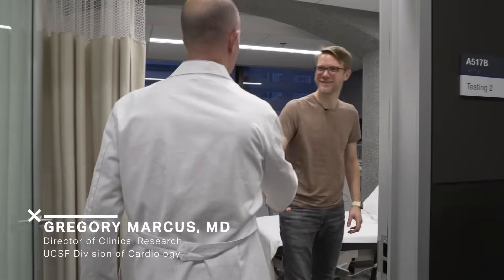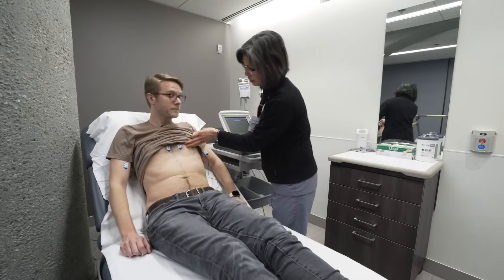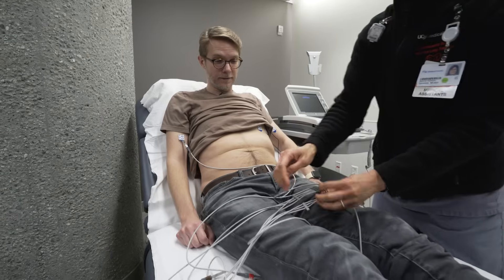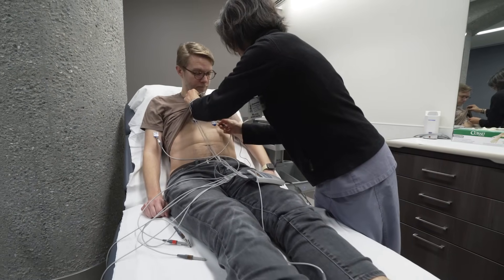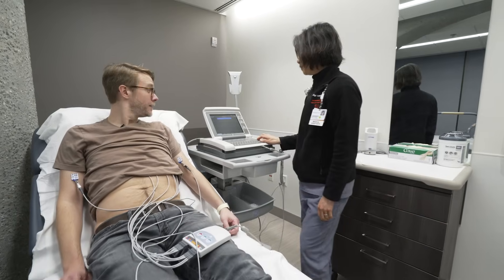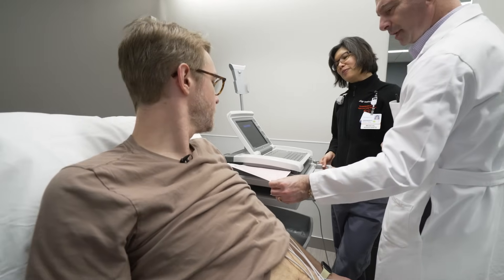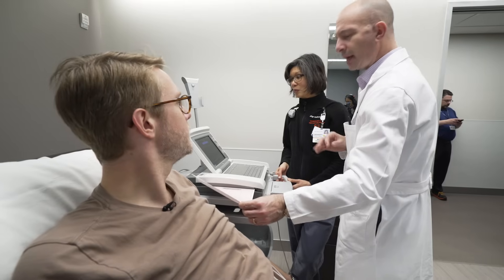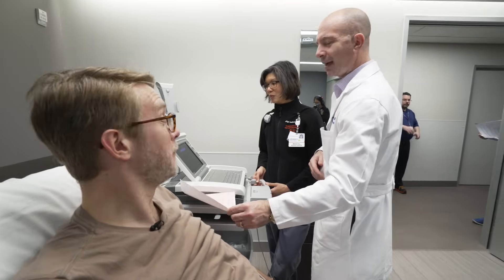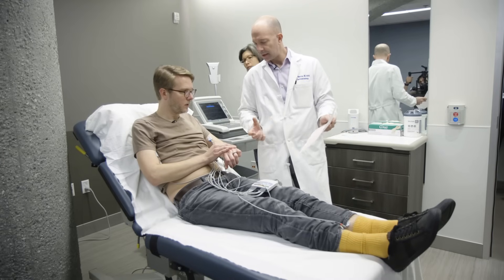Dr. Greg Marcus is a specialist in heart arrhythmias at UCSF. He and medical assistant Vanessa Mullet hooked me up to a lab-grade EKG. It provides 12 different readings of heart activity instead of just the single snapshot that you get on an Apple Watch. You have what's called a sinus arrhythmia, which is a sign of good health. Dr. Marcus walked us through some of the differences between the Apple Watch EKG and this one.